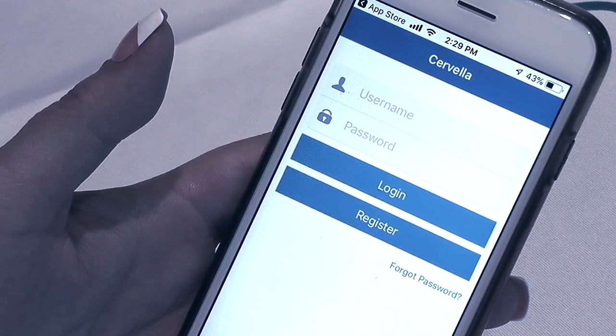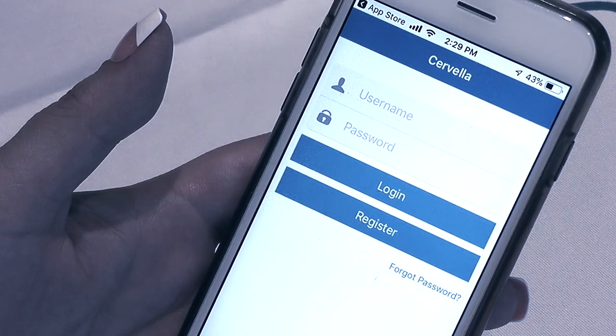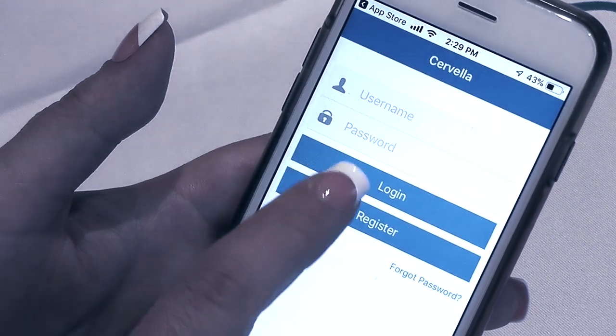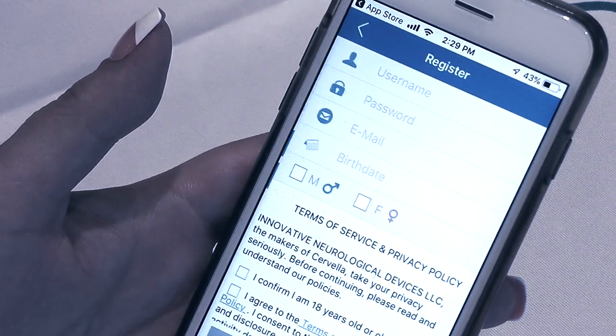For security reasons, we will only store registered users' month and year of birth date, and patient treatment data will be kept in an encrypted and de-identified anonymous format. Note: username and password should be at least six characters long.